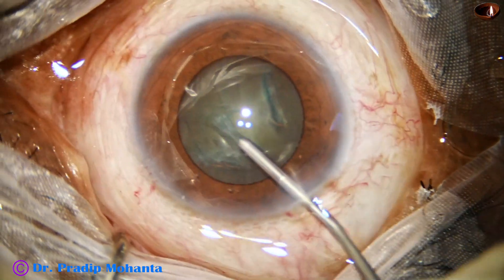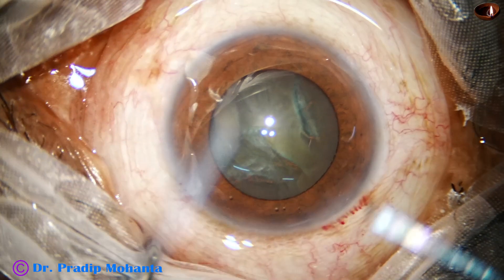Hydrodissection is done. The anterior chamber is again filled up with viscoelastic.